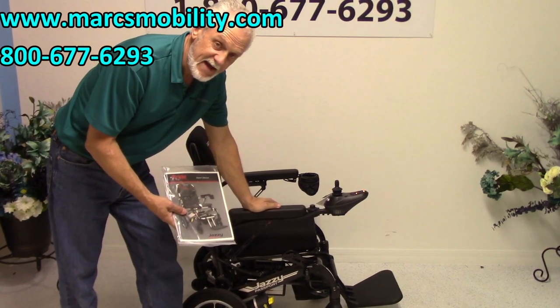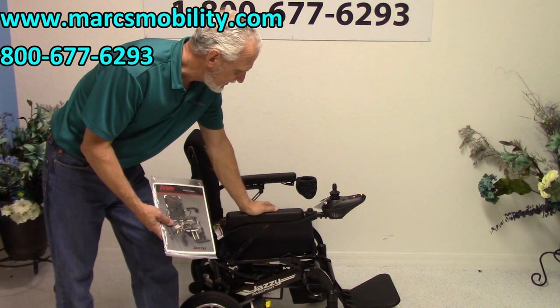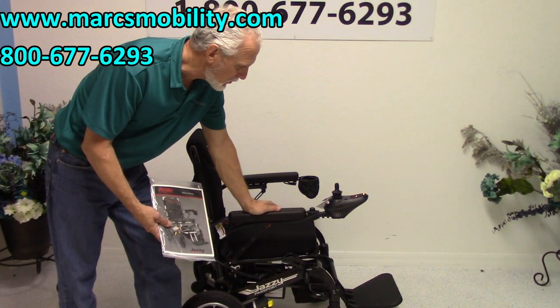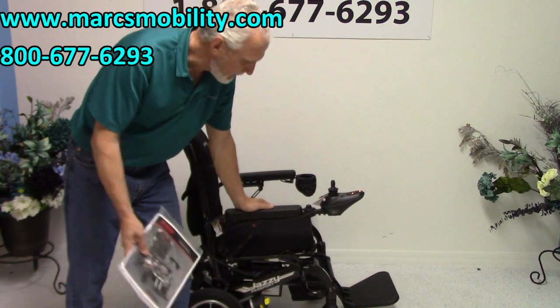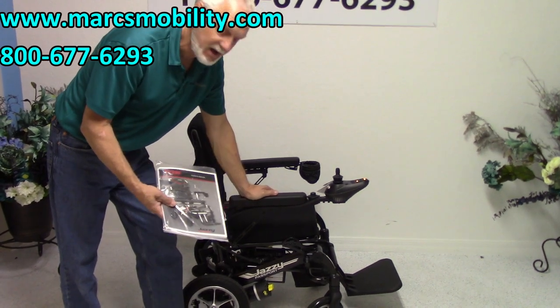This is the brand new Jazzy Passport, made by Pride Mobility, one of the largest manufacturers of power wheelchairs and scooters. This is the new version of the Jazzy Passport. The other one was silver; this one is black with a few additions to make it better.